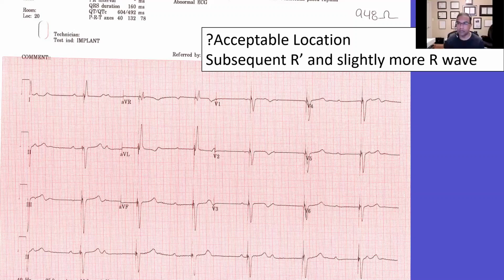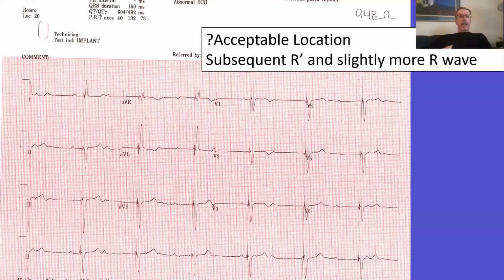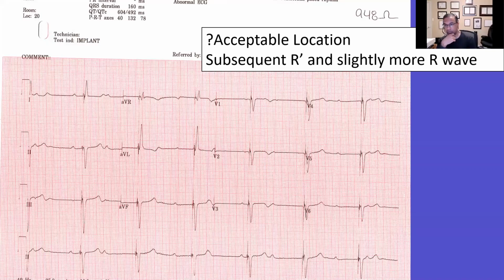Go ahead. I was just going to say, if you look at our recent publication with Santosh, and even more publications coming out, the QS pattern is not an uncommon pattern. It's described in a certain percentage of cases that that's the best pattern that you can get. Well, what about everything else? We have AVR and AVL. I guess AVR has a tiny dip down. But it's the initial part of AVR and AVL that have to be dissociated. So they are actually dissociated.